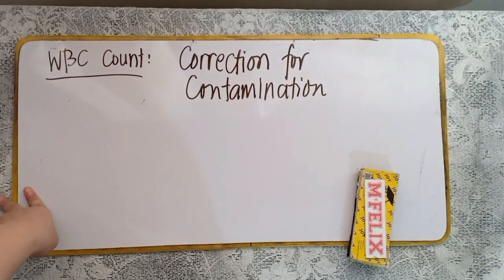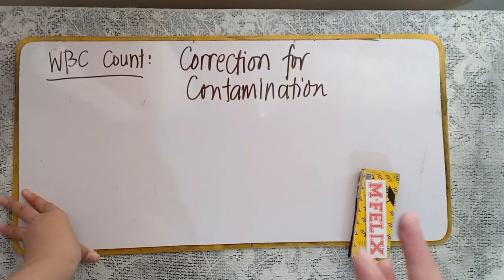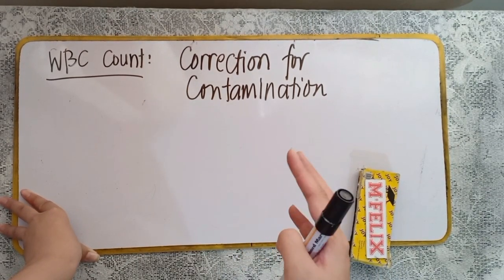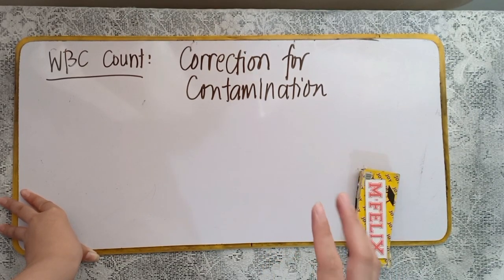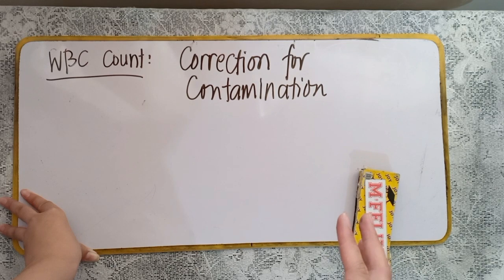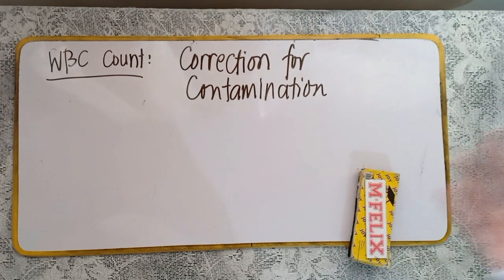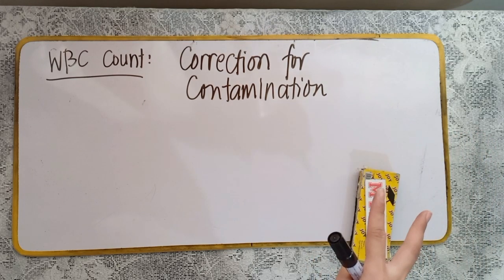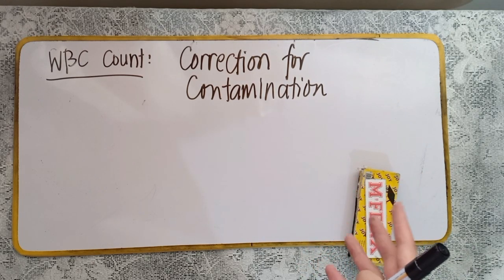Now, calculations are possible to correct, class, for WBCs and protein artificially introduced into the CSF as the result of a traumatic tap. Ito yung tinatawag nating corrections. Kailan tayo magpo-perform ng ganito? Kapag na-contaminate during the traumatic tap, kapag sobrang taas ng WBCs or even the protein. Ulitin natin, class: calculations are possible to correct for WBCs and protein artificially introduced into the CSF as the result of a traumatic tap.